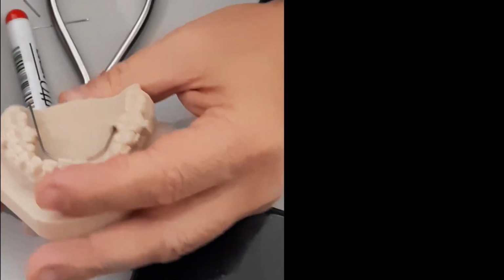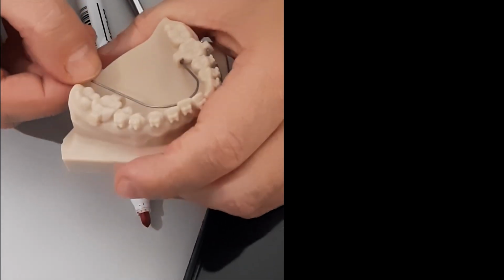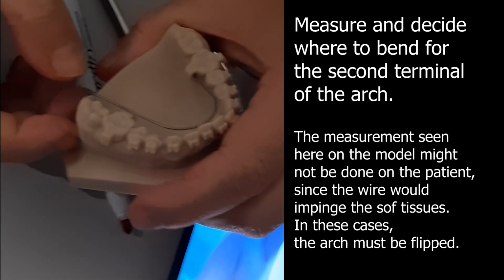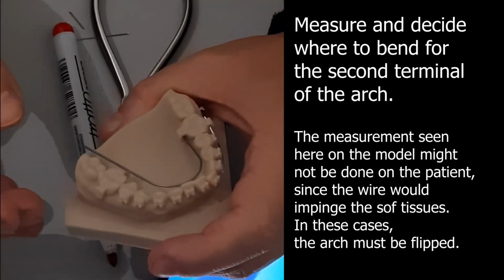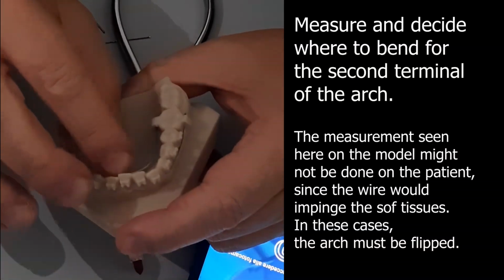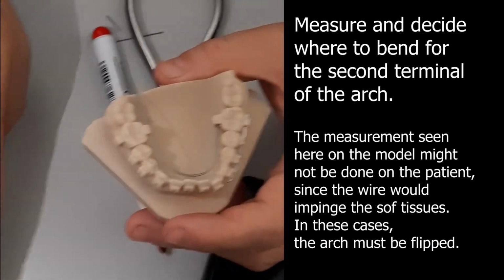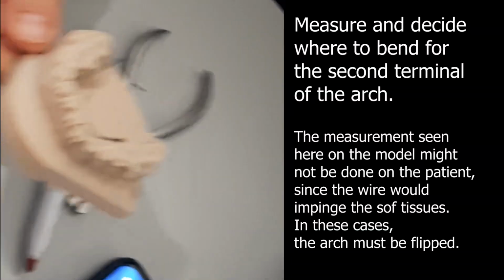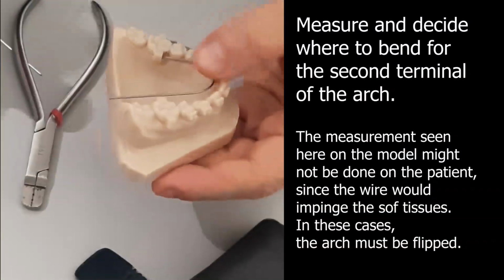It depends what you need to do. I mean, if it's a passive arch, the shorter, the better. So I would do it like this and send it back, send it down. If you have to expand, the longer is the better. And so you need to take a decision. Very often when I do a passive arch, I do it quite short and send it down in this area here, for comfort. So they're not always the same.